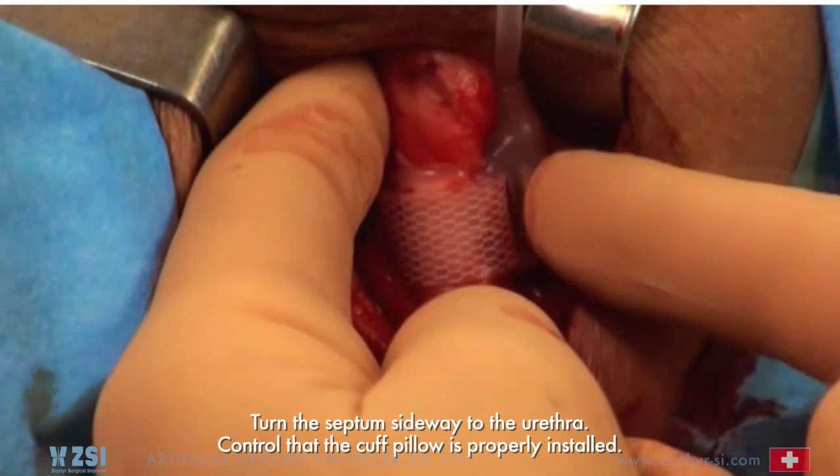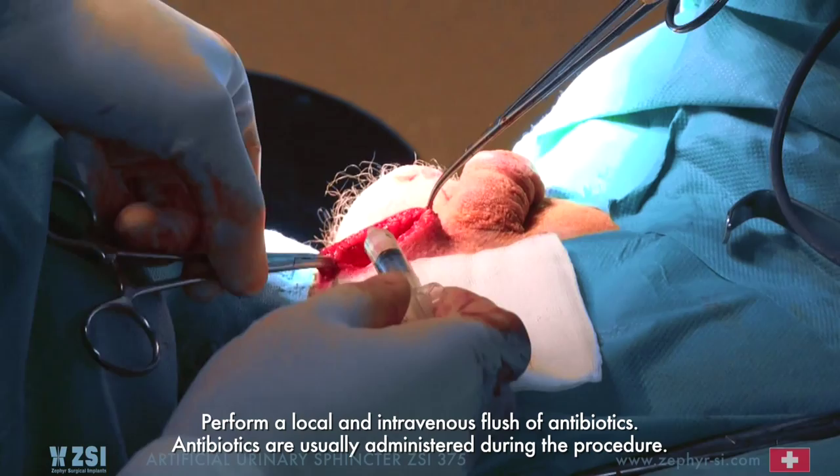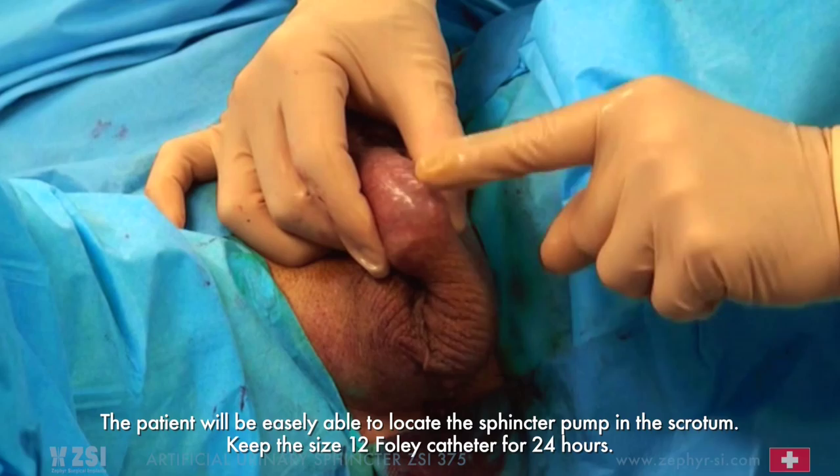Perform a local and intravenous flush of antibiotics — antibiotics are usually administered during the procedure. Close the inguinal and perineal incisions to complete the procedure. The patient will be easily able to locate the sphincter pump in the scrotum. Keep the size 12 Foley catheter for 24 hours.